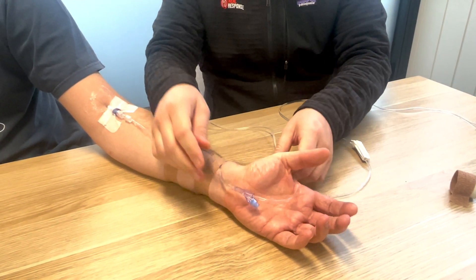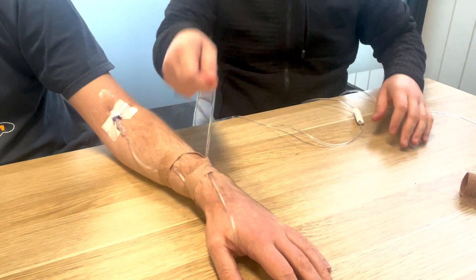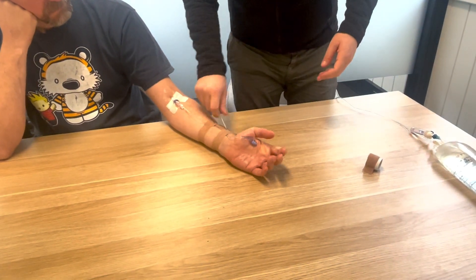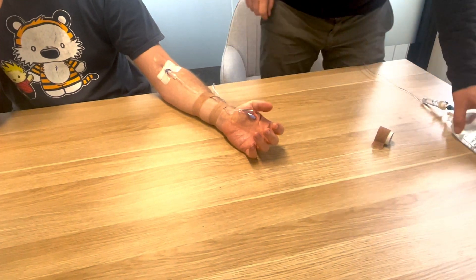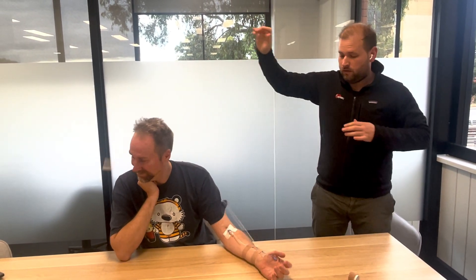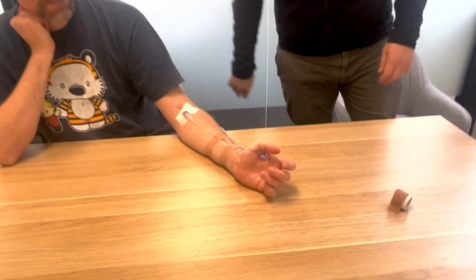I've still got access to the port if I need it. But now if we have a look here, this is really tight — this is actually going to prevent it pulling out here. If I pull here, it's going to pull on his thumb, it's not going to pull the cannula out. I can grab this bottle and with a decent amount of force throw it, and you can see here it doesn't pull it out.